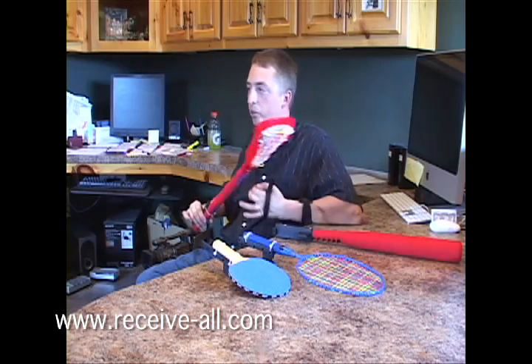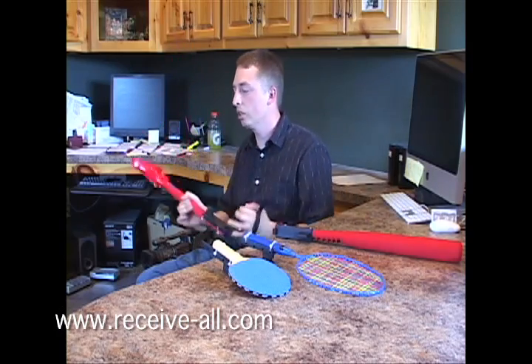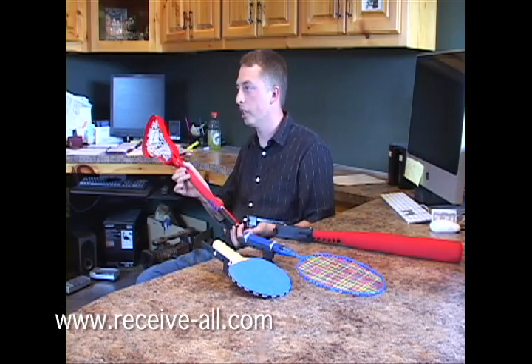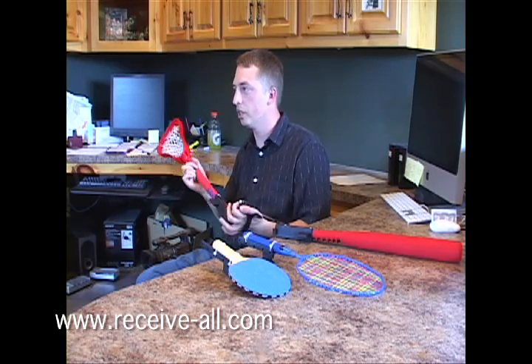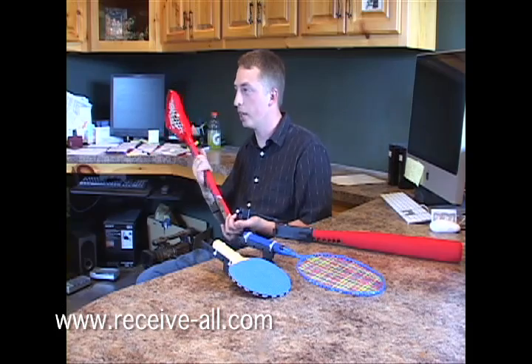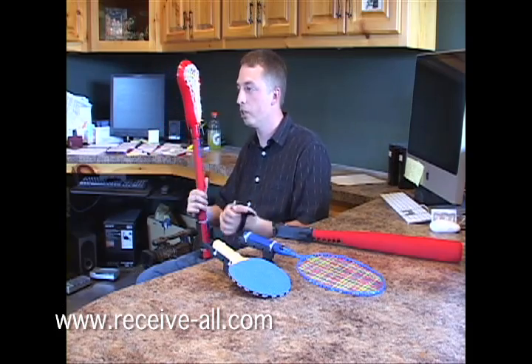For somebody who can't throw or catch or scoop a ball off the ground, we have just a youth lacrosse stick. Very simple. It's lightweight, can be attached, and there the kid, again, can participate in something that maybe he couldn't otherwise.